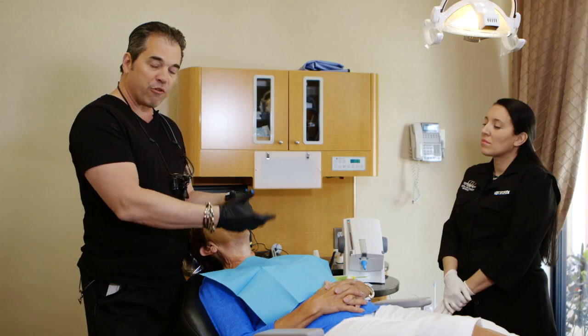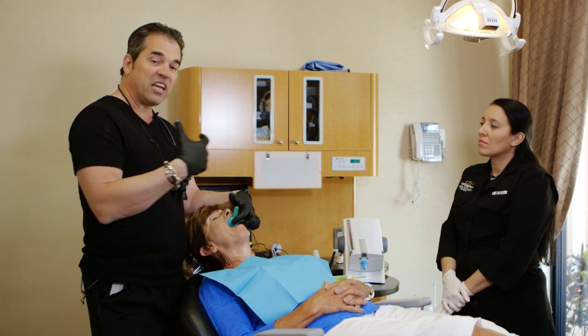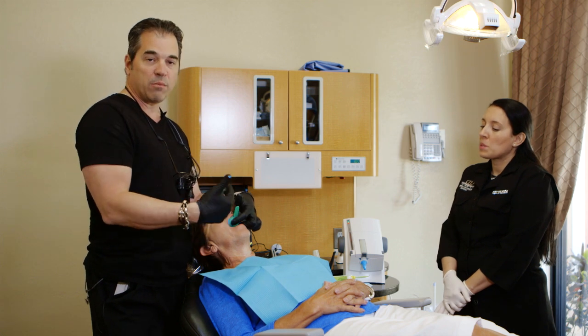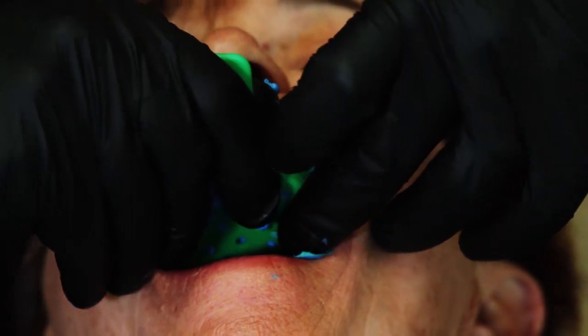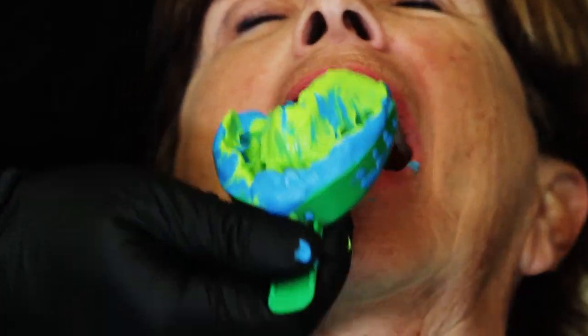A lot of times with Imprint 4, again, because of the cost factor, we're able to use the same exact material to take an opposing. This way now the laboratory can pour up as many opposing models as they need to. We're about at the point right now, we can go ahead and pull this, and we're gonna go ahead and do that. Just bear with me here. Here we go. And there we go. Thank you, thank you, thank you.